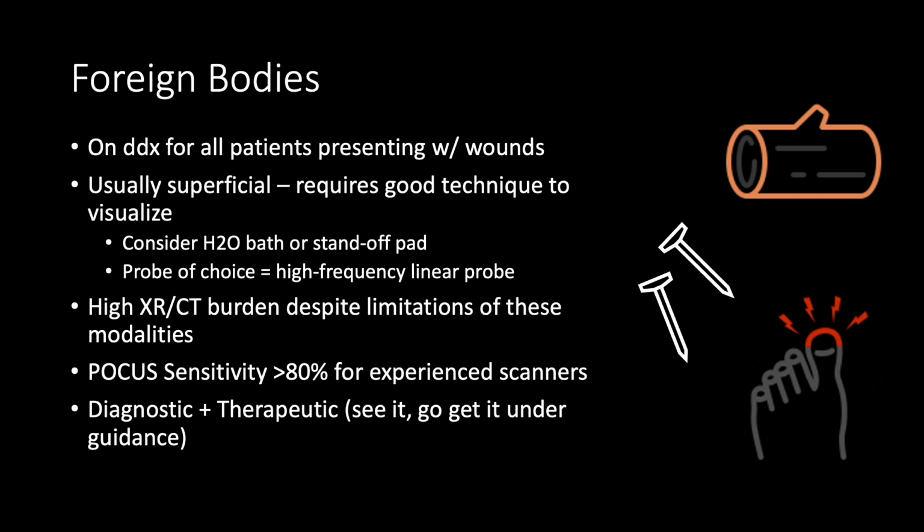So for this reason, I often use a standoff pad, such as a gel mound, or a bag of saline, or a glove filled with water, or I immerse the patient's extremity in a water bath when attempting to visualize these bodies.